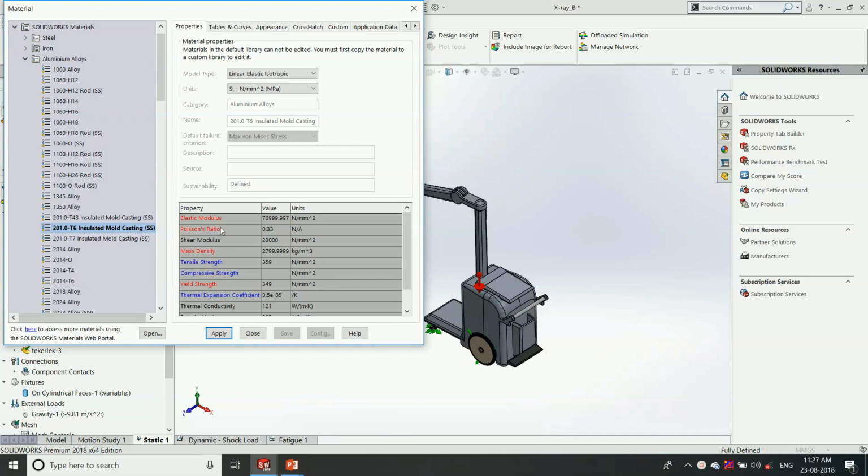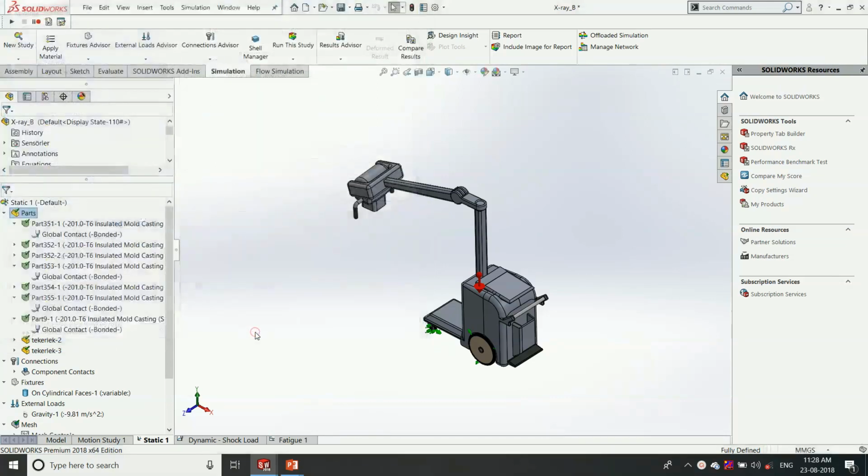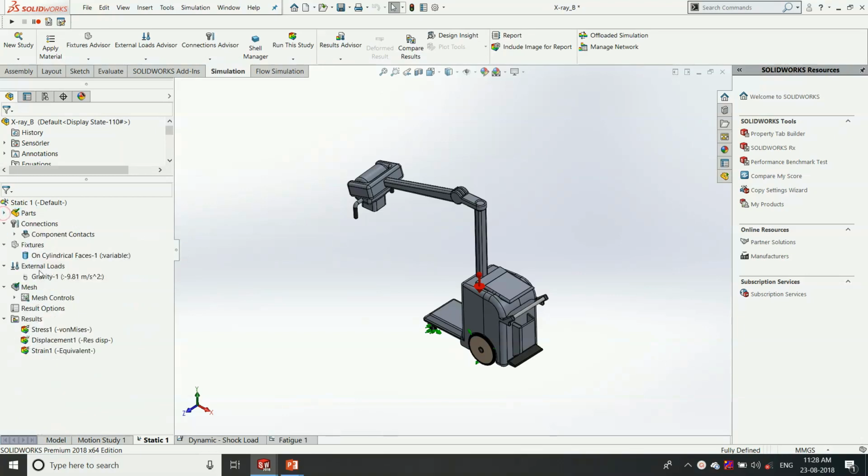So whichever are in the red region are compulsory for this study, and these material properties are already in the material database of SOLIDWORKS. So by clicking apply it will be defined for the list of materials here. Then by choosing the boundary condition: SOLIDWORKS Simulation has 5 simple steps: applying the material, then the boundary conditions, where we produce fixtures and external loads, then meshing the model, then running it and post-processing the study to see whether it's satisfying or not.